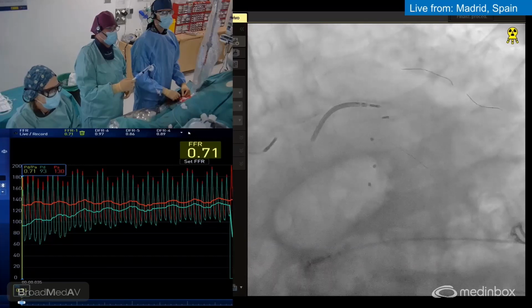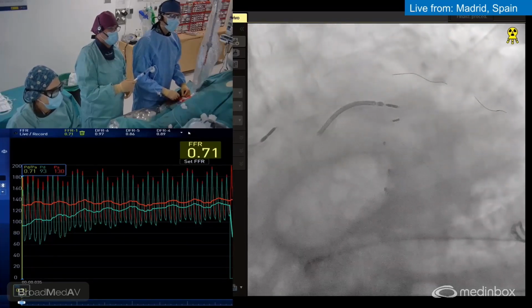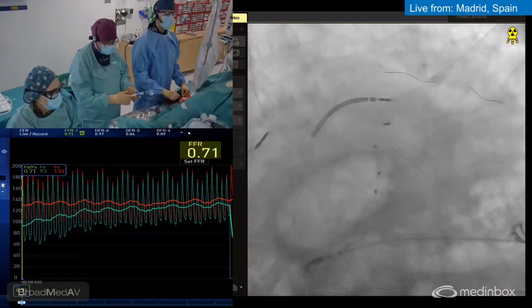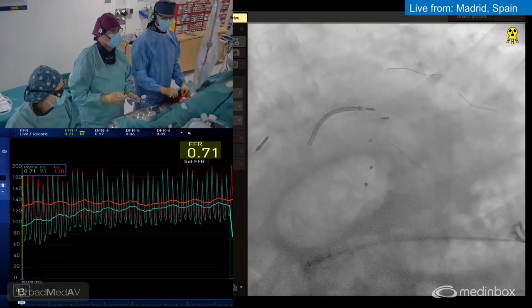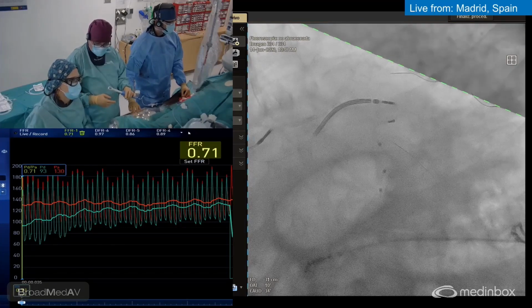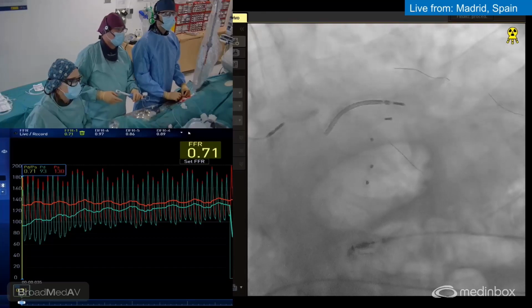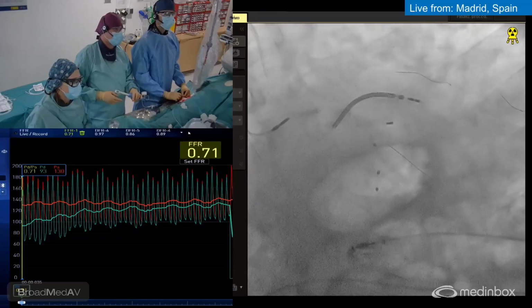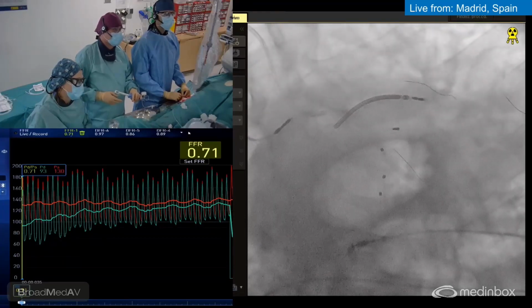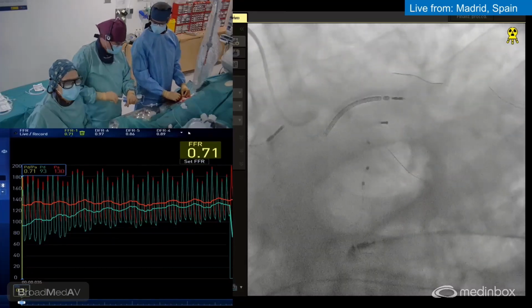Let's see the balloon cross. It has crossed, no? I think so. Okay. One second only. Ok, test, Carmen, por favor. Hay mucha agua, ¿vale? Ok, I think we are there.